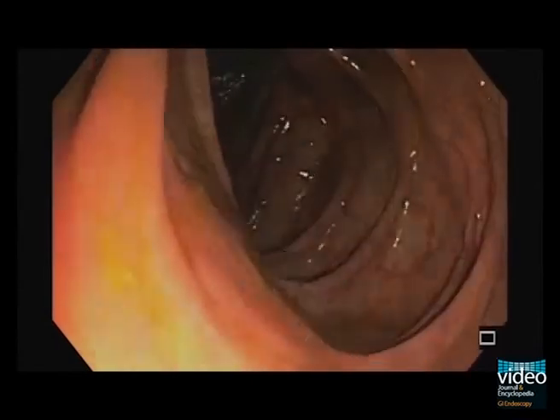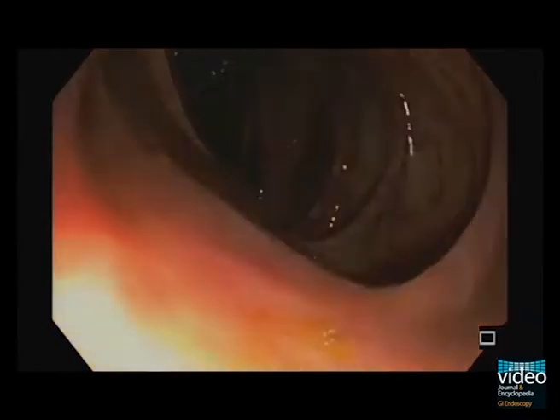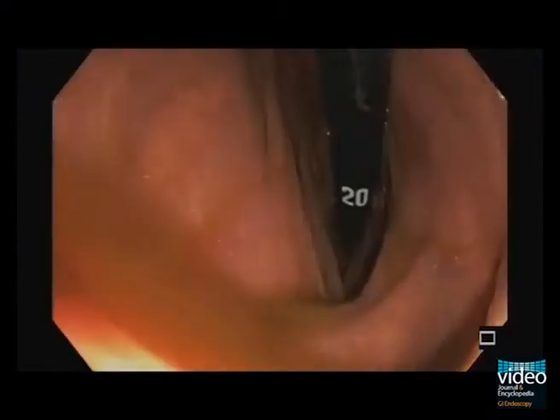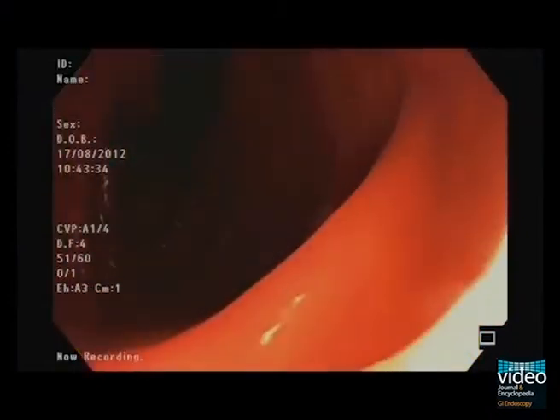Blind areas may exist in the cecal pole between the ileocecal valve and appendix. This area should always be directly visualized. Likewise, at the hepatic flexure, a blind spot may exist, and this may be best evaluated by careful retroflexion of the scope in the cecum.